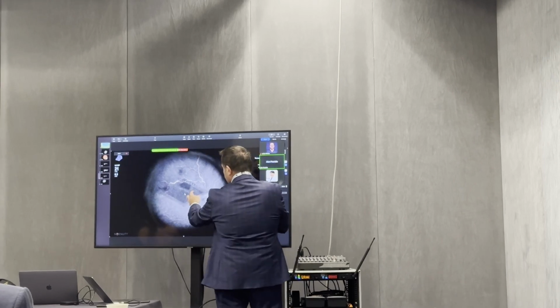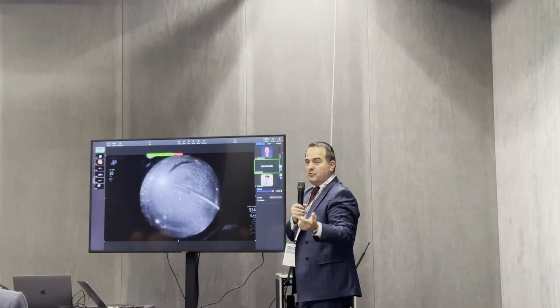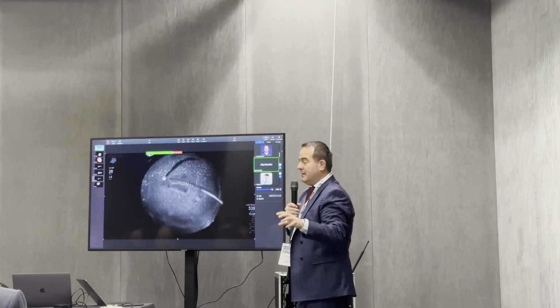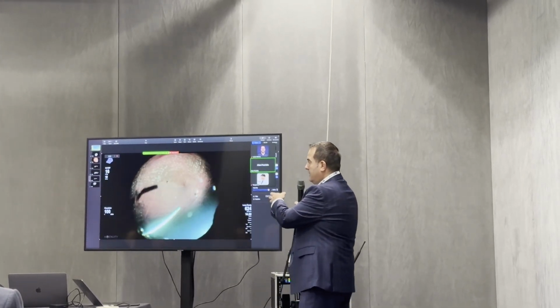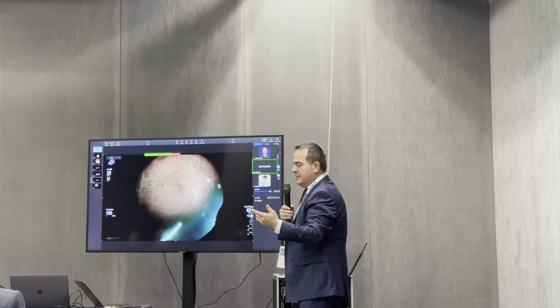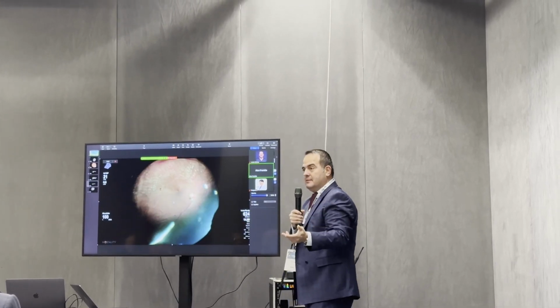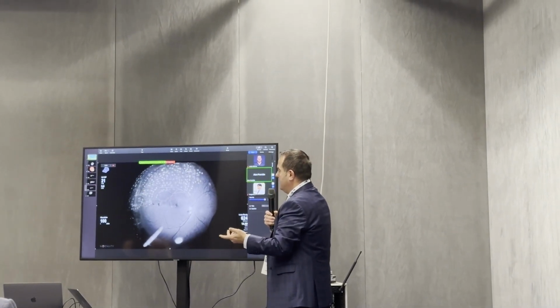Obviously, here we have a perfusion, but probably with microperimetry we might catch the problems. And here in the vascular cases, as I said, it's really important to have a, let's say, navigated laser, because we will be more precise actually.